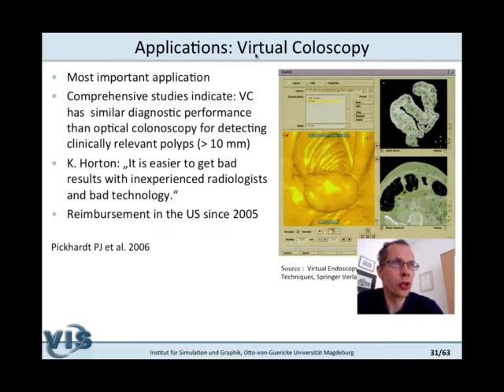It's just a visual exploration of the human anatomy. And thus we probably cannot detect inflammation, which often is quite important. But we can see changes of walls, and that relates, for example, to polyps in the colon that are often benign predecessors of a later colon cancer. And by removing these polyps, we can avoid this. That is a brief recap from the last video lecture.